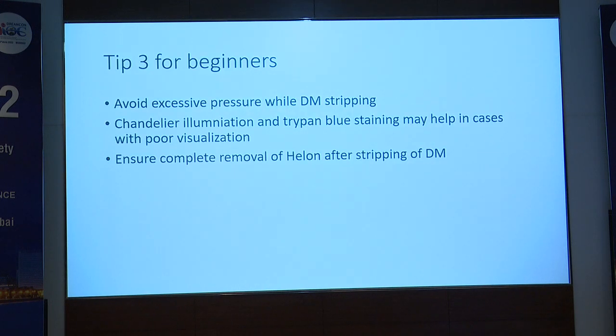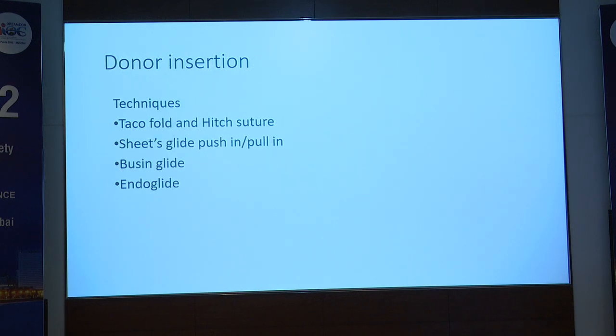Again, for beginners, they can use Healon in the anterior chamber so that it's easier for them to strip the Descemet membrane, and ensure a complete removal of the Healon after stripping the Descemet membrane.